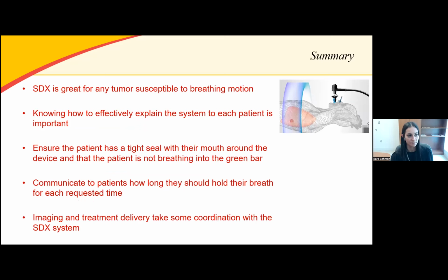So in summary, SDX is a really great option for any tumor susceptible to breathing motion. Knowing how to effectively explain the system to each patient is important. Again, like I mentioned, a lot of patients are really adamant about mastering this technology. So you just want to be mindful as the therapist to provide helpful advice to them in order for them to be a good SDX candidate.